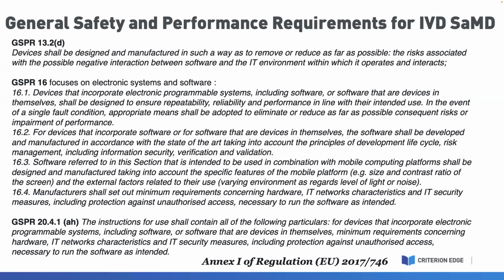And then GSPR 16 is really focused on the software, and that's going to describe some of those analytical features, which we mentioned before, things like repeatability, reliability, and performance that's aligned with the intended use. But it should take into account the development life cycle and your risk management. So that's the other aspect to keep in mind. There will be some minimum requirements concerning your hardware, your IT networks, security, protections, those sorts of things that you should also take into account to ensure that the software runs as intended.